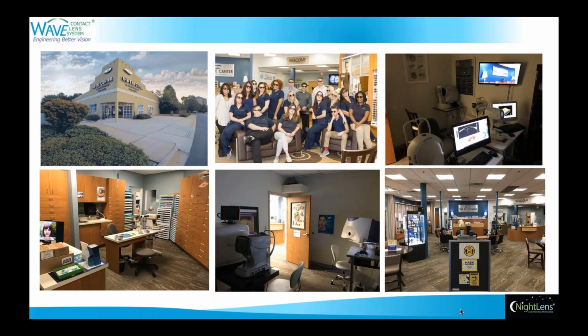This is our building, and we've got a staff of around 20 wonderful people, many of whom have been with me for 20 years. The picture in the upper right is our special testing room, where you can see we cram a lot of stuff in a small space. We've got the Aiden in there, and the Oculus visual field, and the OCT, and of course the Pentacam.